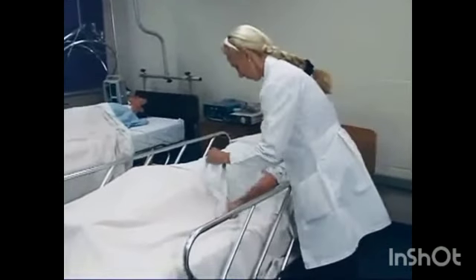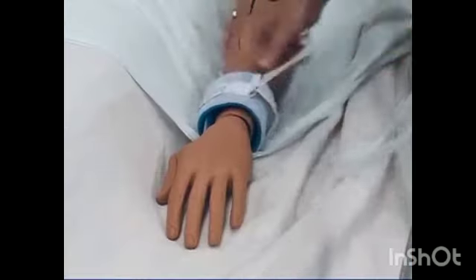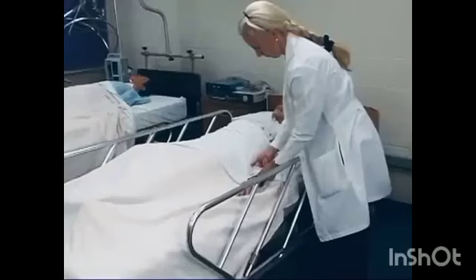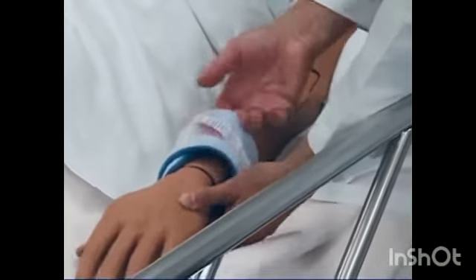To apply wrist restraints, wrap the padded portion of the restraint around the wrist or ankle and tighten the strap securely. Be sure to leave a two-finger gap between the restraint and the client's wrist or ankle.